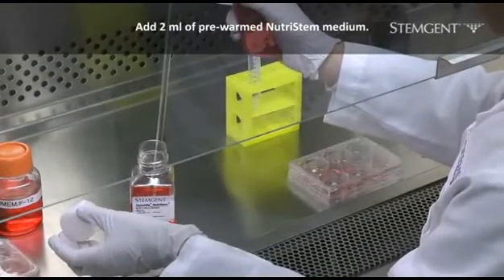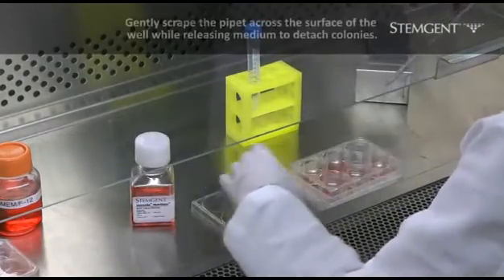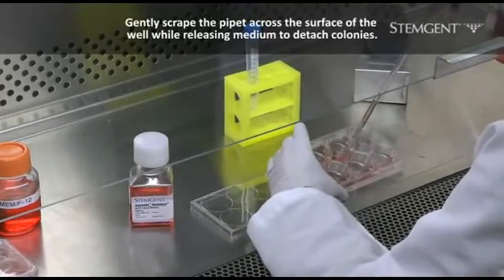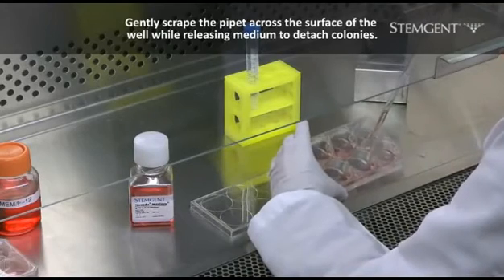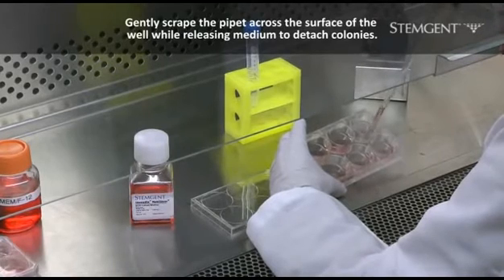Next, add 2 milliliters of pre-warmed NutriStem medium to the well. Using a 5 milliliter glass pipette, gently scrape the tip of the pipette across the surface of the well while slowly releasing the medium to detach colonies.